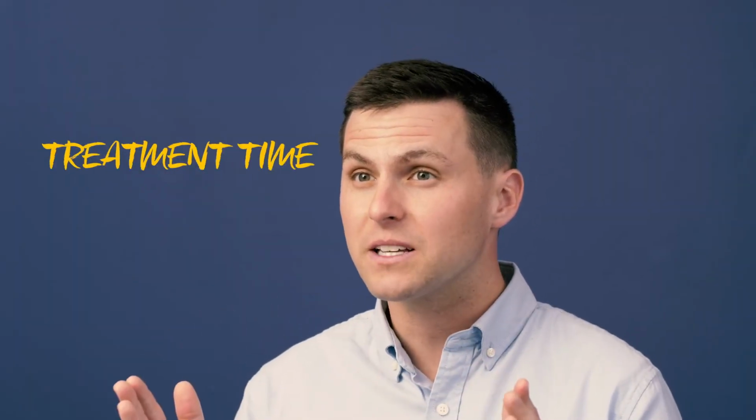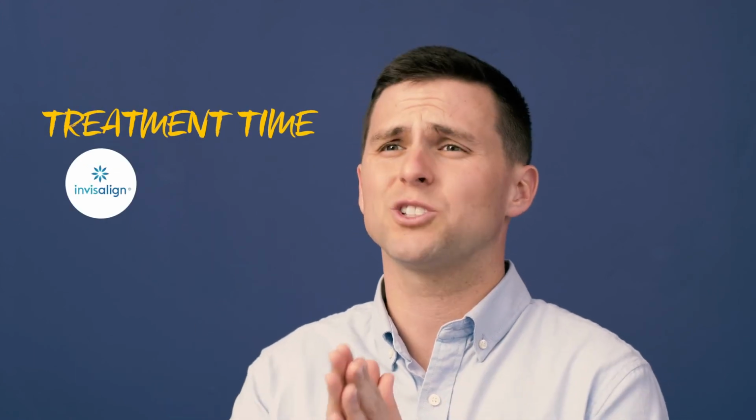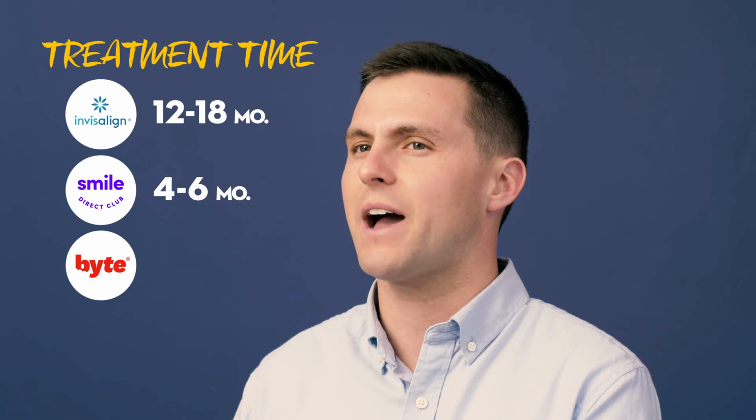We get a lot of questions about the amount of time it takes to complete a treatment plan. It's pretty simple. Invisalign, you have some doctor's appointments and things, so it's gonna be 12 to 18 months with them. Smile Direct Club, 4 to 6 months, not too bad. And then Byte can be a little bit shorter time because of their HyperByte device. They claim as low as 3 months using their product.